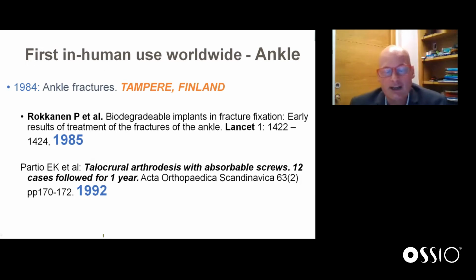So graduating residents and fellows of any specialty today that are entering private practice and clinical practice right now, or even this year or next year, were not even born then. So just to give a little historical perspective, which I think is kind of fascinating. And then a study here, 1992, which was the published 1-year follow-up already. So the minimum 1-year follow-up. And so even in ankle fusions, absorbable screws were being used completely, solely absorbable fixation in the early 1990s.